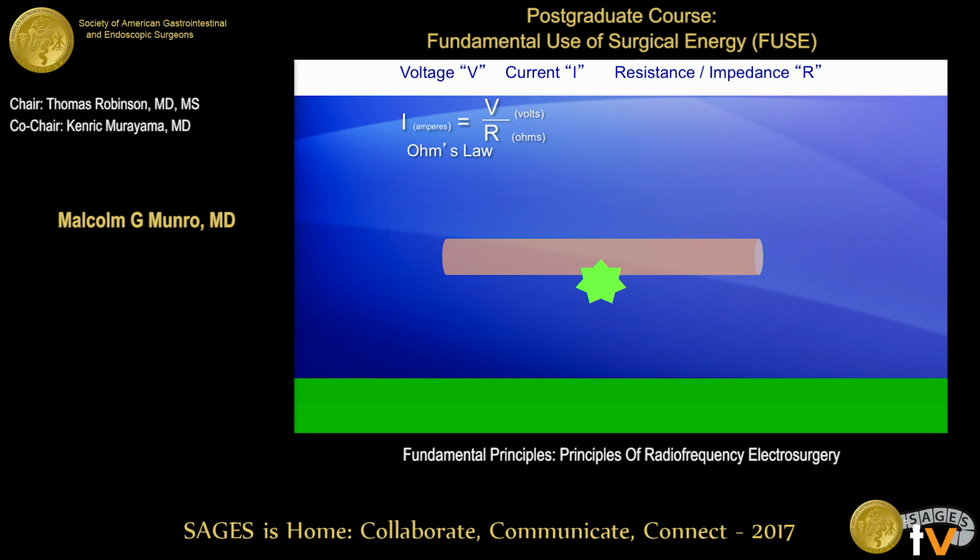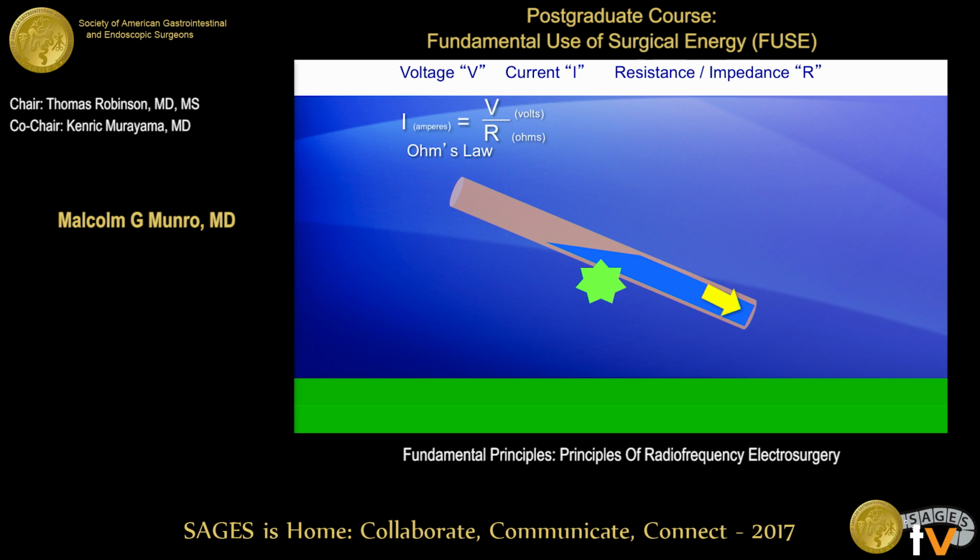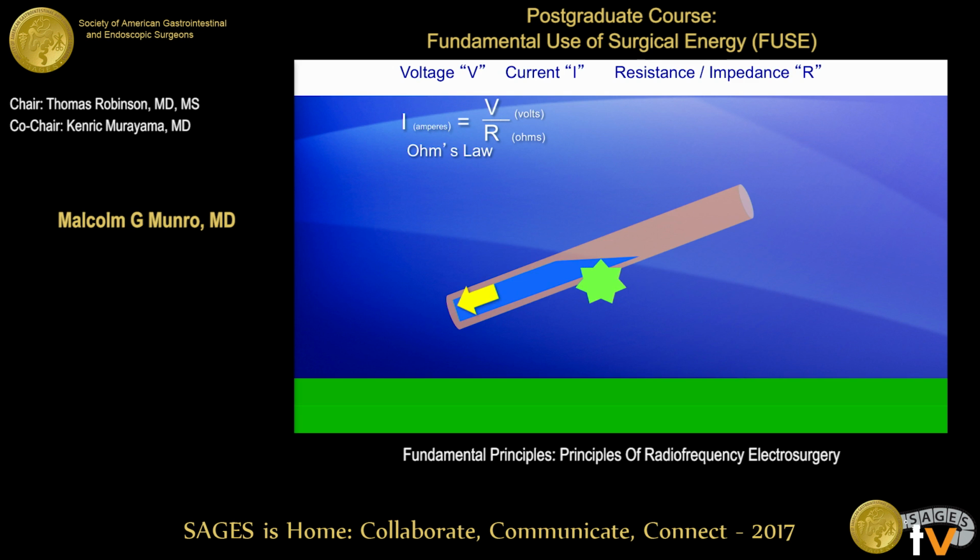the analogy with the water tower I gave you was one that fits best for direct current or constant polarity circuits. But we aren't dealing with a constant polarity. We're dealing with an alternating polarity. So this water tube analogy actually makes a little more sense. If I fill this water tube and I tip it this way, okay, then I tip it this way, I'm spinning my little wheel, which will generate power, but the water's really not going anywhere, all right?